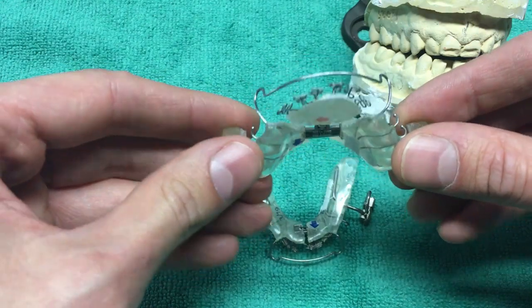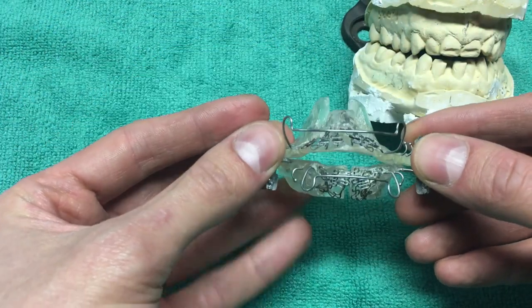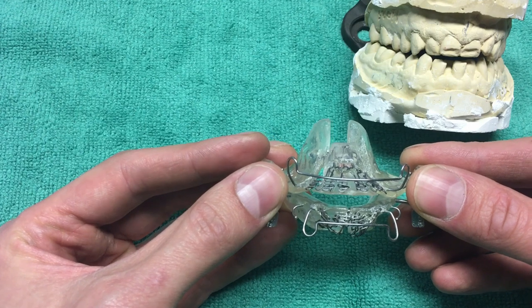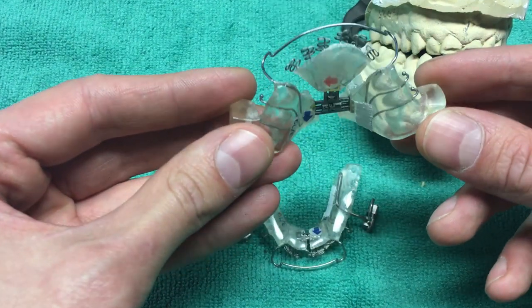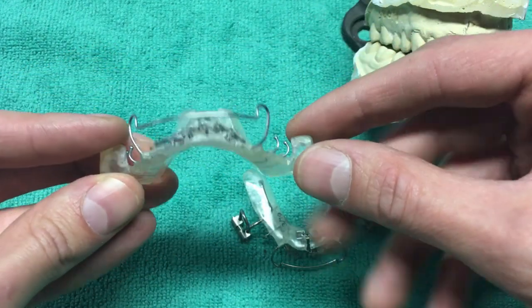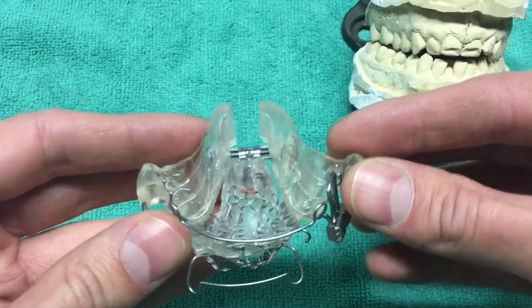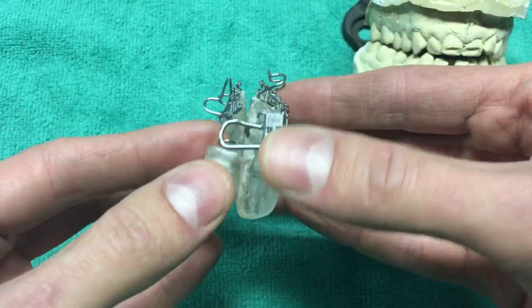This goes in and snaps in. There are two different versions — there's the MRNA version, which is this one, and then there's also the regular DNA appliance. The normal DNA appliance does not have these wings on the side. Because I have sleep apnea, these wings are specifically used to keep my lower jaw from falling back when I sleep.